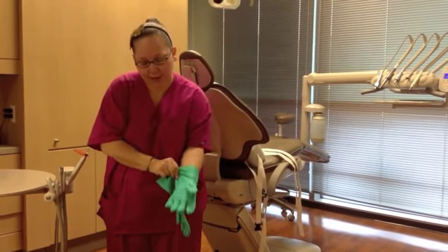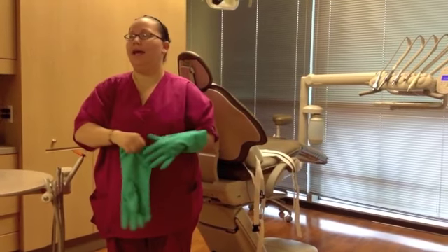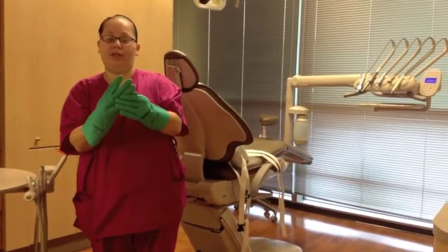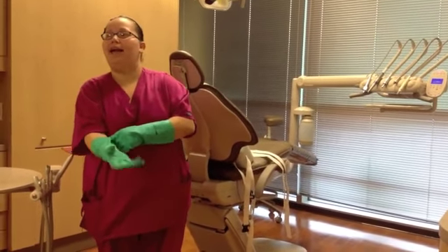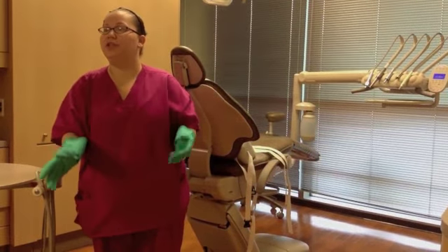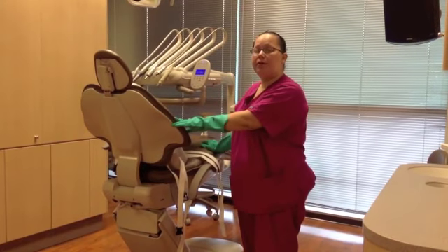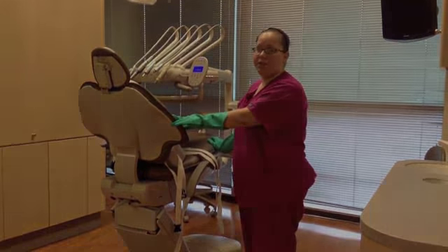After doing that, we will flush the handpieces and the air water syringes. We'll run the solutions through the evacuation hoses, and we'll clean the traps and the filters and maintain the water reservoirs. After cleaning the dental treatment room, we're going to put the dental chair into the right position for housekeeping.